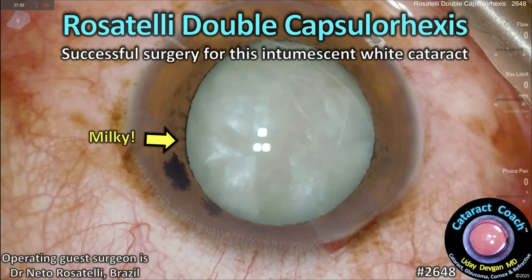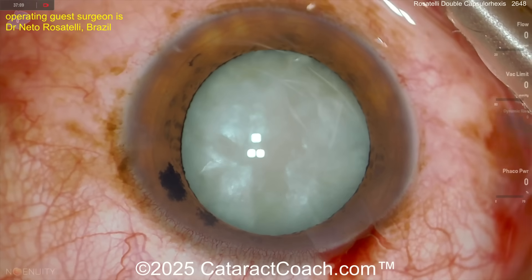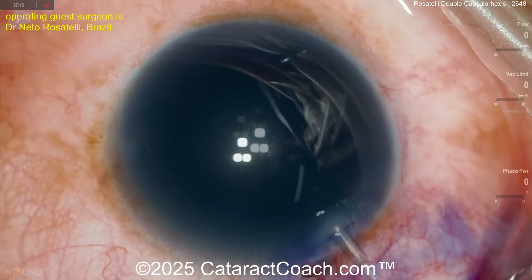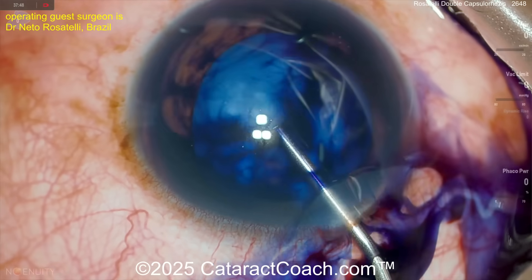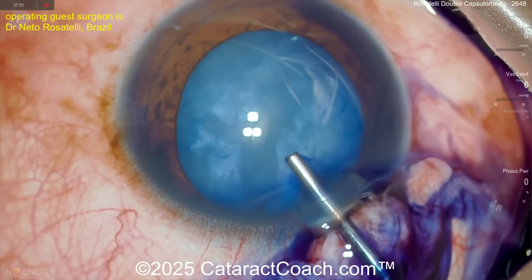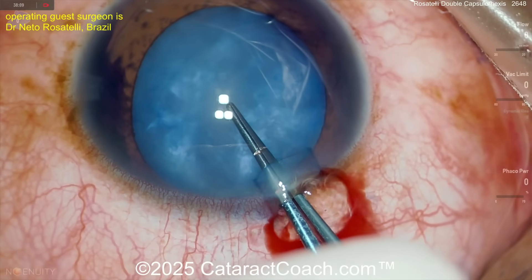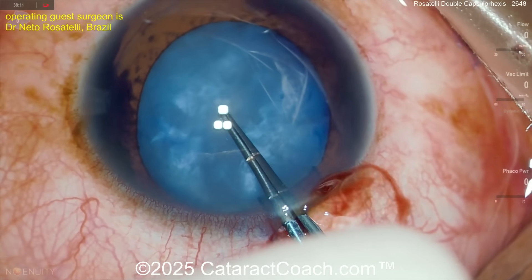From cataractcoach.com: the Rosatelli double capsulorhexis for a successful surgery on an intumescent white cataract. Look at this milky thing. Netto Rosatelli is our favorite surgeon to watch online — he's incredible. We have a tough case here. Tripan blue dye goes in, followed by viscoelastic, and we need to get the rhexis done. First we'll do a double rhexis, so poking in here.